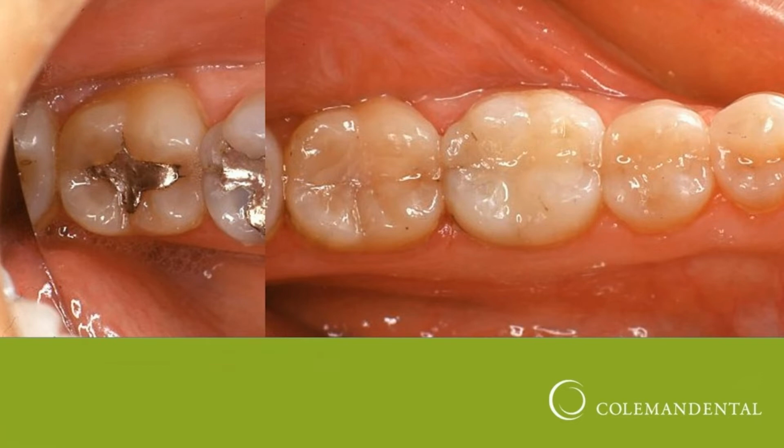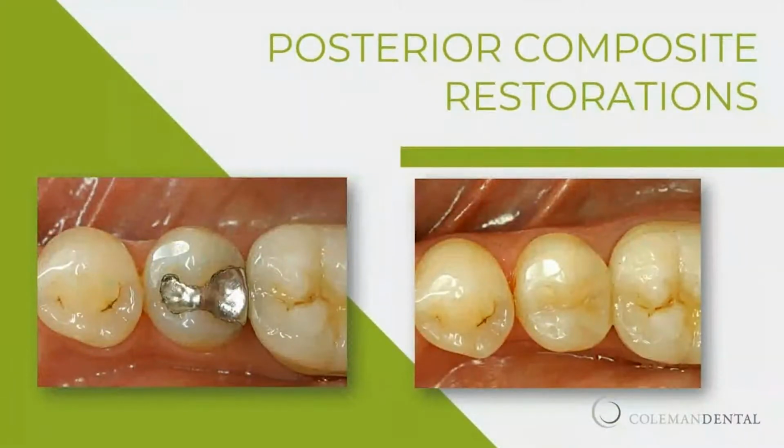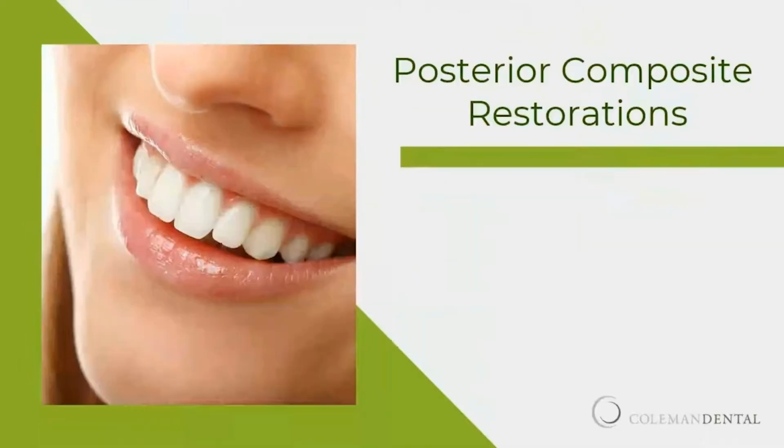I'm going to share with you what I do today and have done for the last several years routinely for all of my posterior composites. If we think about a posterior restoration, in this case a class 2, we're going to remove an amalgam and place a composite. Now, this composite here is about 5 years old, and it's really a good restoration, a little dull, it's lost a little bit of its luster, but still very functional, works great. That's the kind of restoration that we want to be able to do routinely without post-operative sensitivity or people having problems with it.